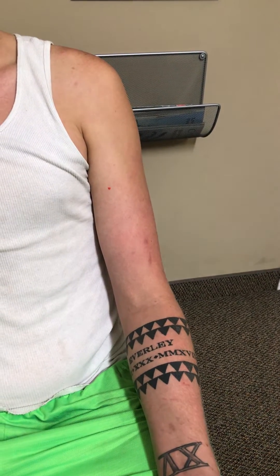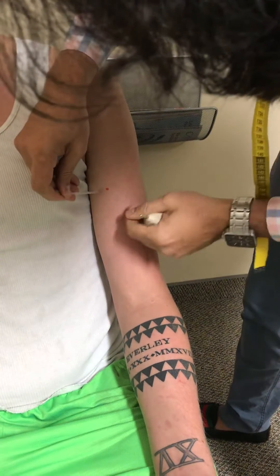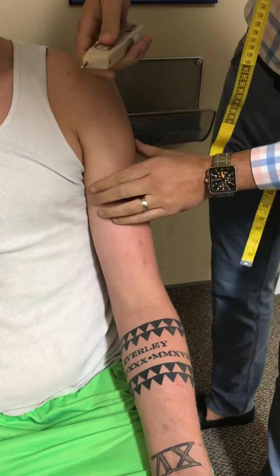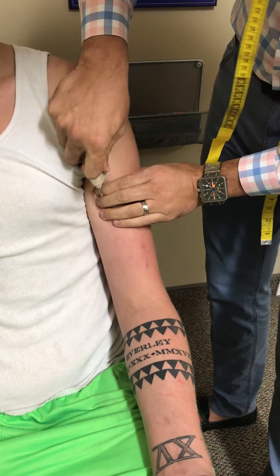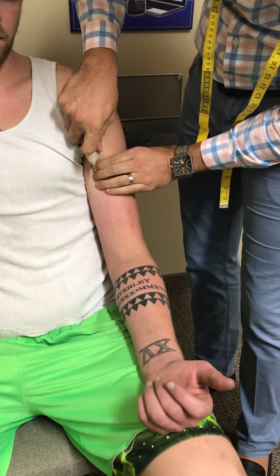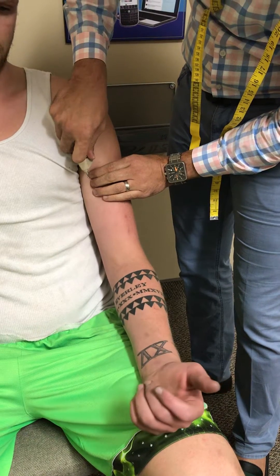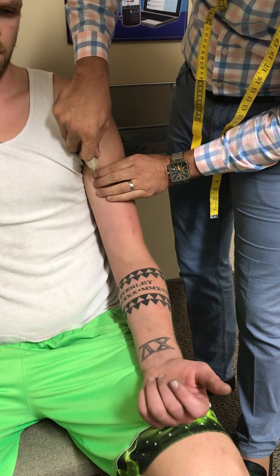Next we will needle it. The top of the anterior axillary fold, 4 inches distal, would be right here. Advancing the needle — and as you can see, there's flexion. Step back so you can see his arm as well. This is the biceps brachii motor point, 4 inches distal from the anterior axillary fold, in someone who's 6'9".